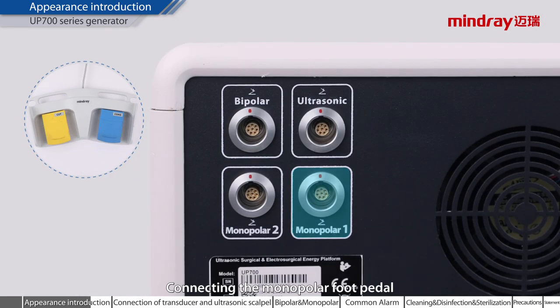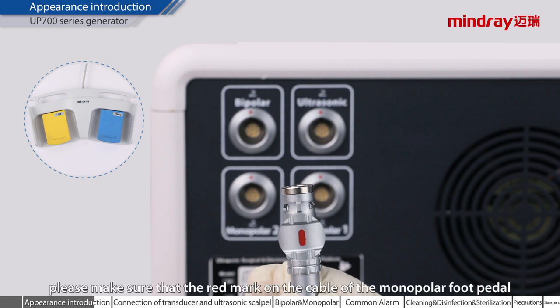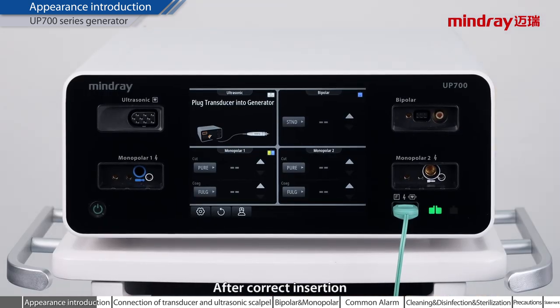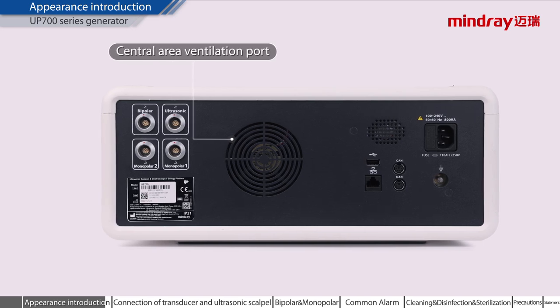Connecting the monopolar foot pedal. When connecting, please make sure that the red mark on the cable of the monopolar foot pedal and the red mark on the socket of the generator coincide. After correct insertion, the monopolar function area displays that the foot switch has been plugged into the monopolar sockets. The foot pedal icon will be displayed in the upper right corner of the monopolar function area. Central area ventilation port.